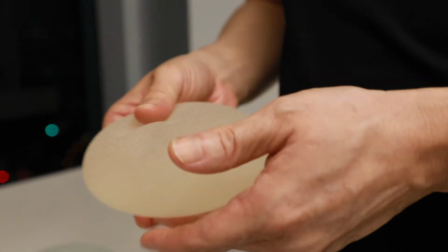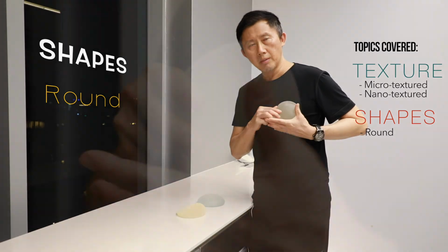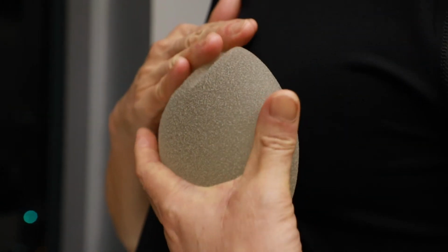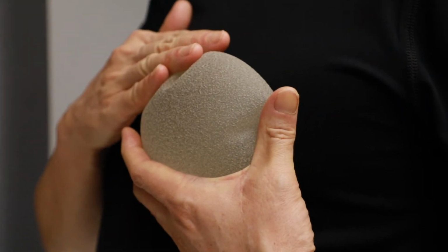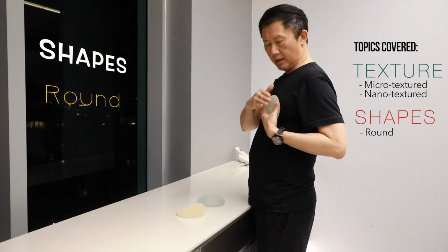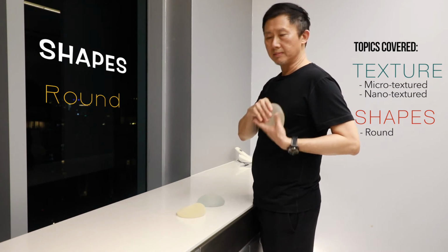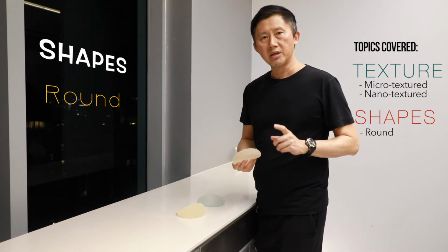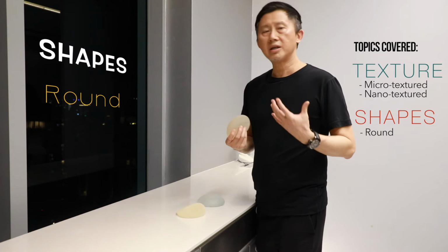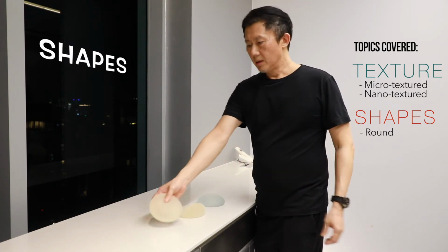So this dome shape, when it is placed in the body, the problem is that the upper part of the breast may end up looking a little bit too full. So in profile view, it may bulge a little bit too much in the upper pole of the breast. So that's not the most natural of shapes, because a natural breast does not bulge in the upper part.